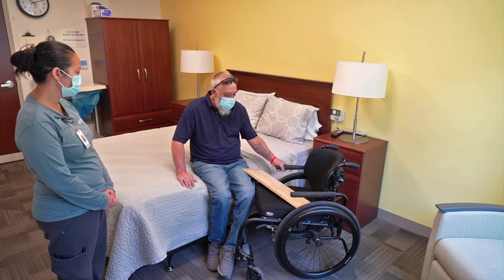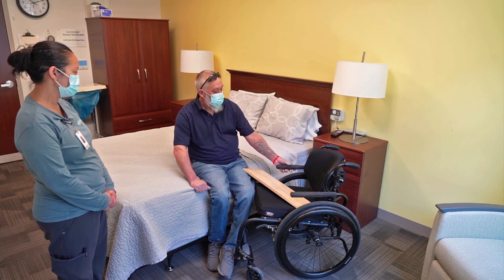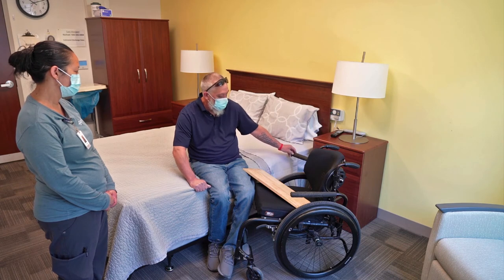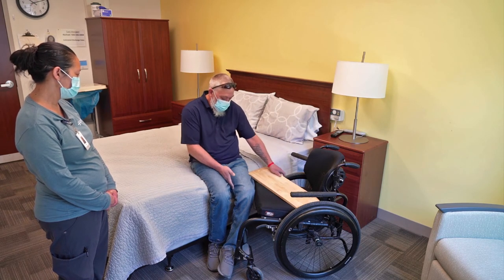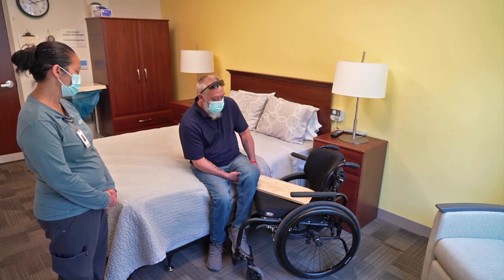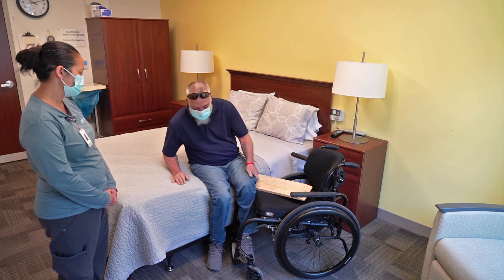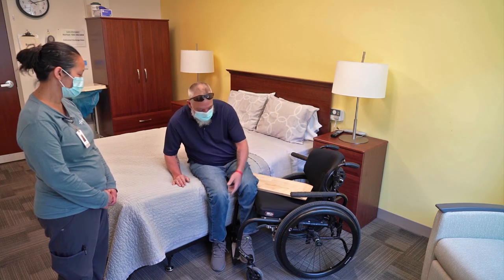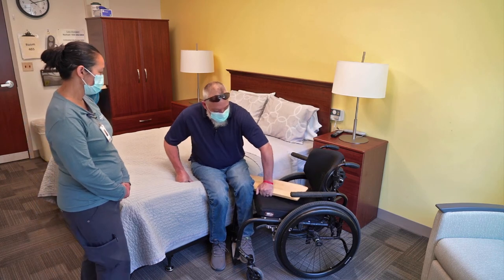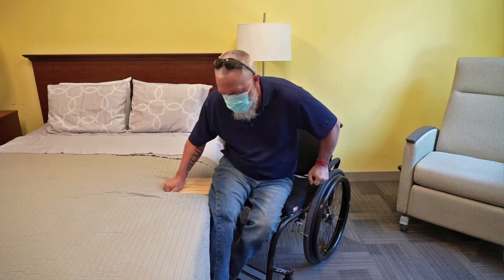Now we're going to transfer back to the chair from the bed. This handle is going to be in my way if I don't move it, so I just transferred — get it out of the way. Again, I'm going to lift up my opposite leg — the left leg this time. And again, you always want to make sure your feet are in a good position so when you transfer they're not all twisted up. So again, I've got it underneath my hip, lift my weight up, and just slide over.